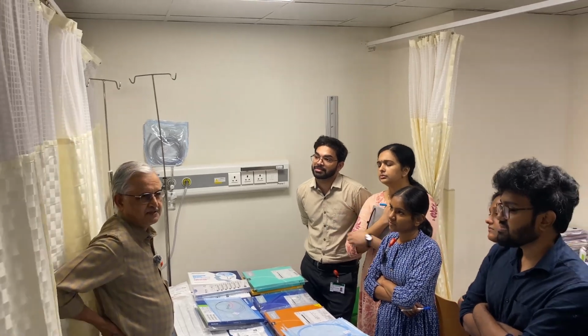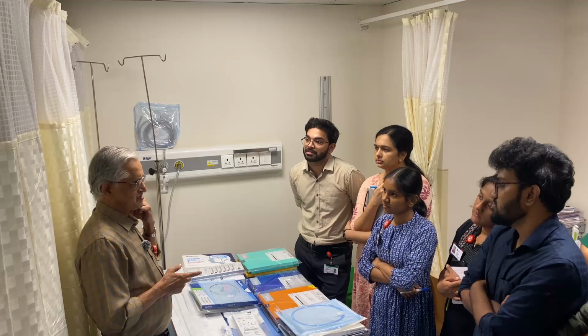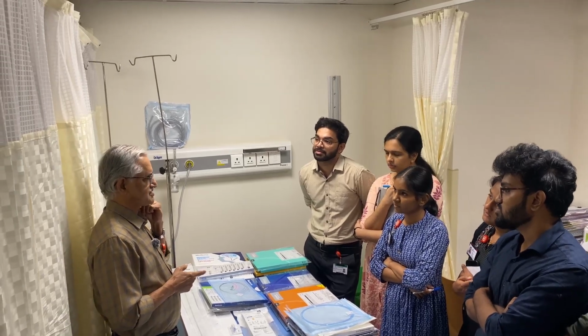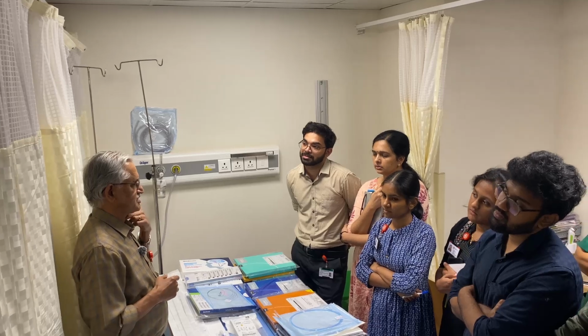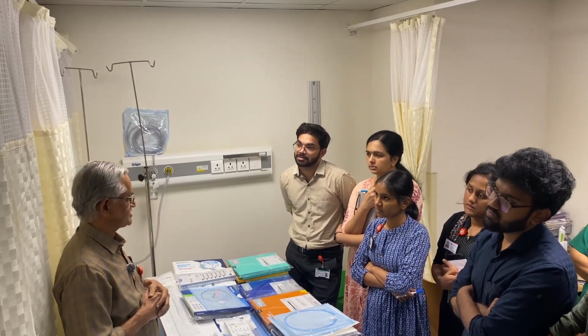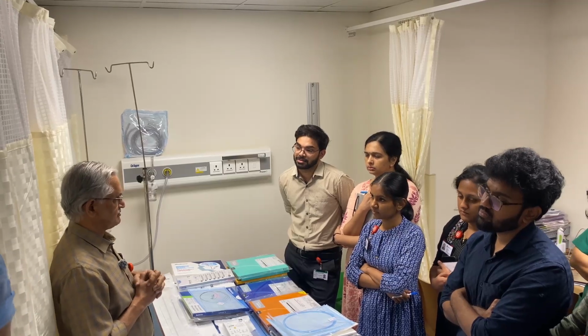Neurointerventions, basically, we do only 3-4 things. One is carotid angioplasties. Whenever there is a stenotic lesion, if it is dilatable and stentable, you use the carotid stents. Do a balloon dilation and then apply the stent. That is one of the commonest.